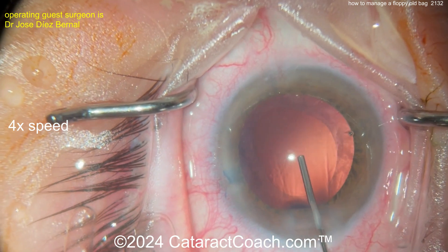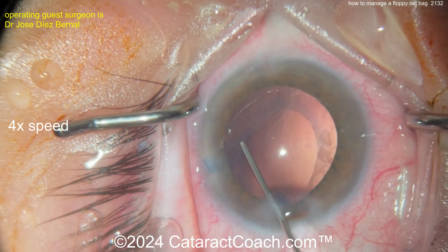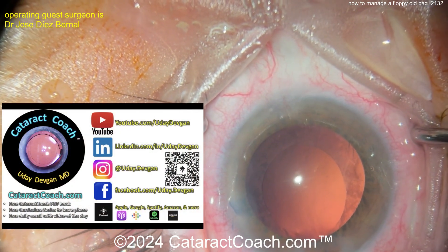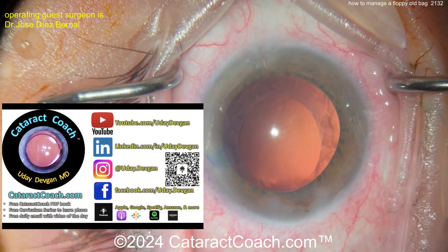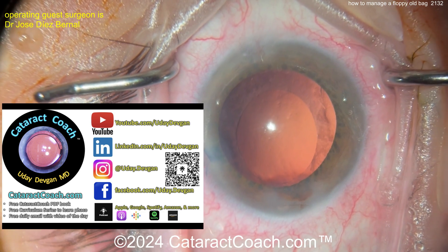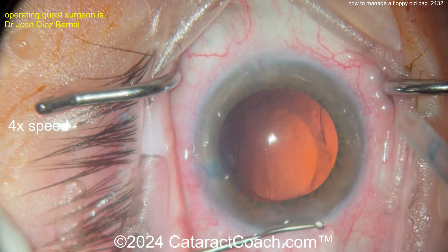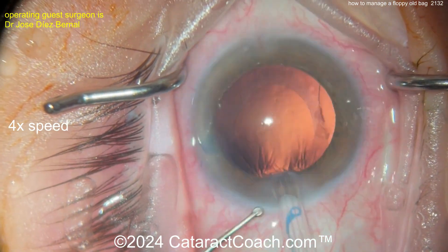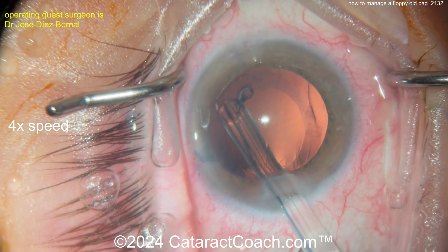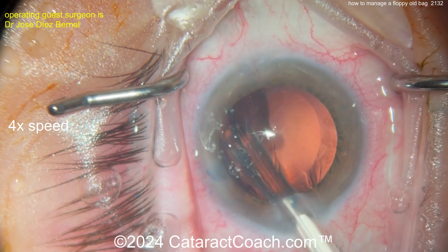Viscoelastic going in. I like a CTR — let's see what the surgeon does. I'm watching the video for the first time with you. The viscoelastic in the bag looks pretty good, but you're not going to leave the viscoelastic in. Check out CataractCoach.com — fantastic search engine, you can see all zonulopathy cases, organized by keywords. Here comes the CTR — look how much the rhexis has moved. Being very cautious inserting the CTR, slowly putting it in with the injector. Look at the movement of the bag, look at the rhexis changing — and getting that in. Very nicely done.